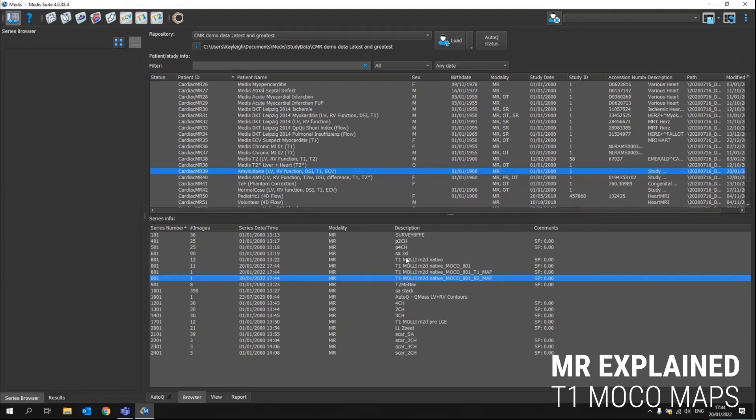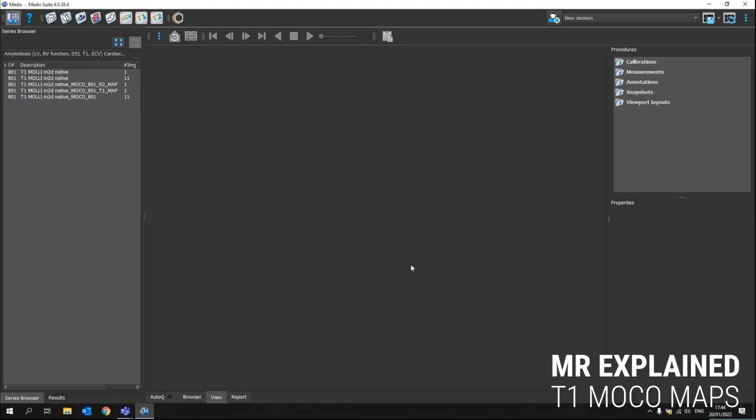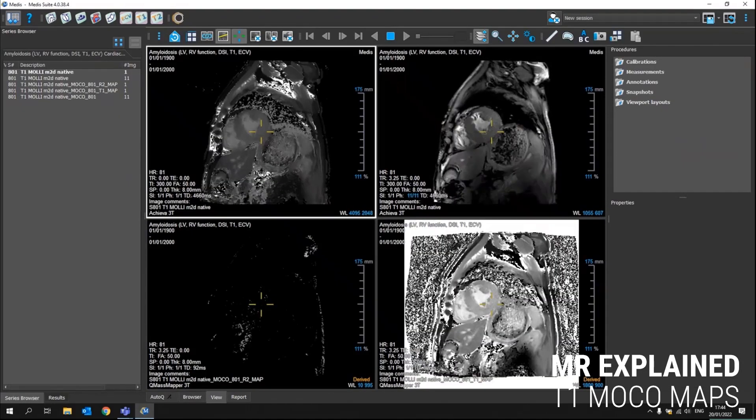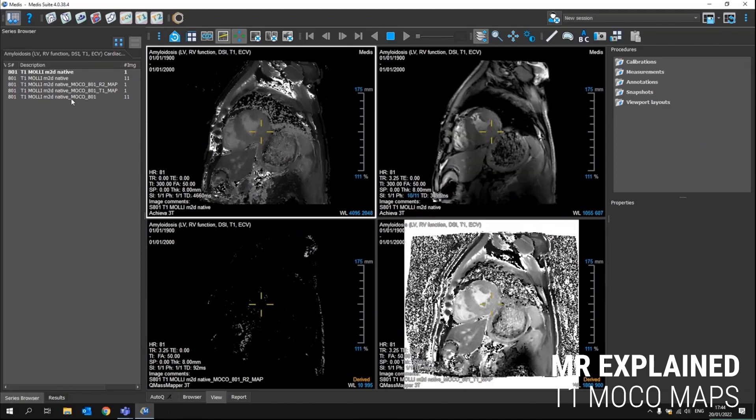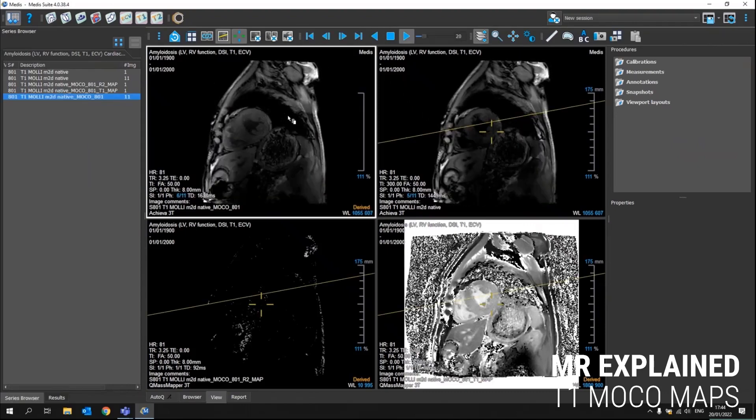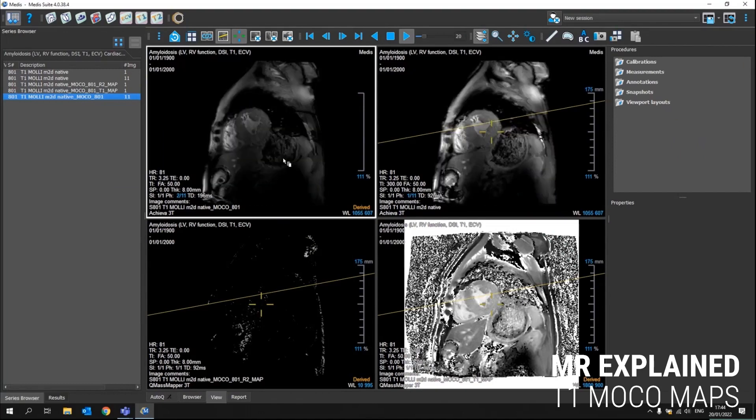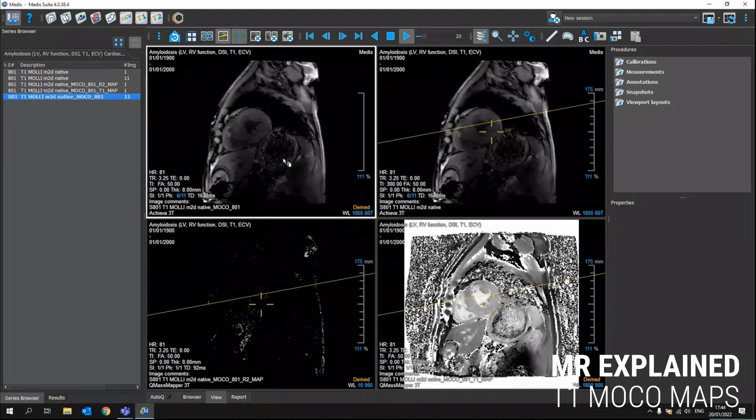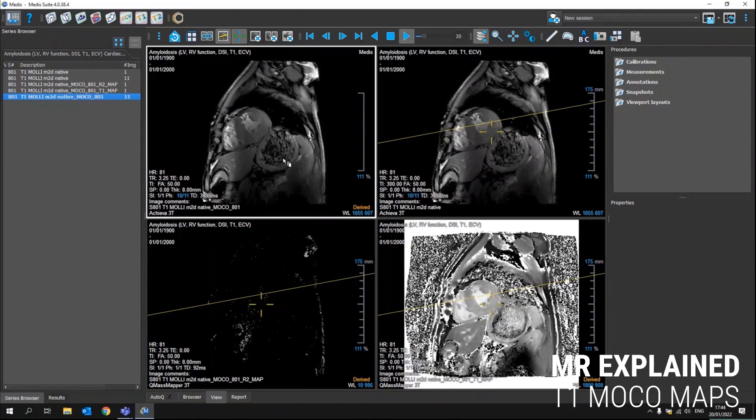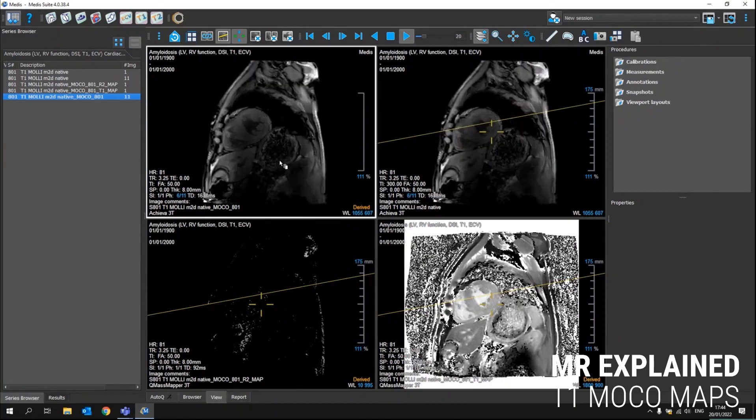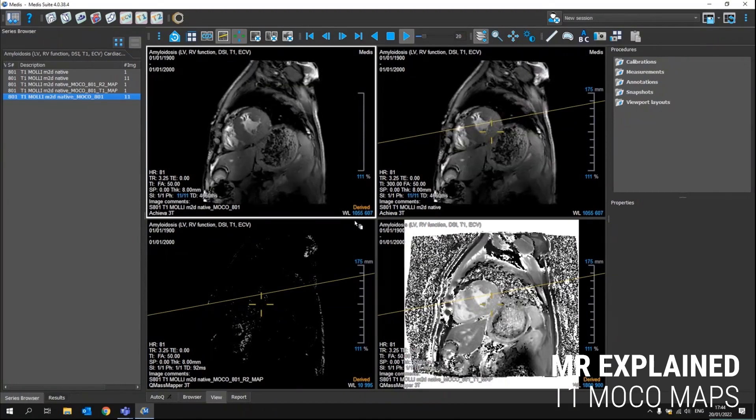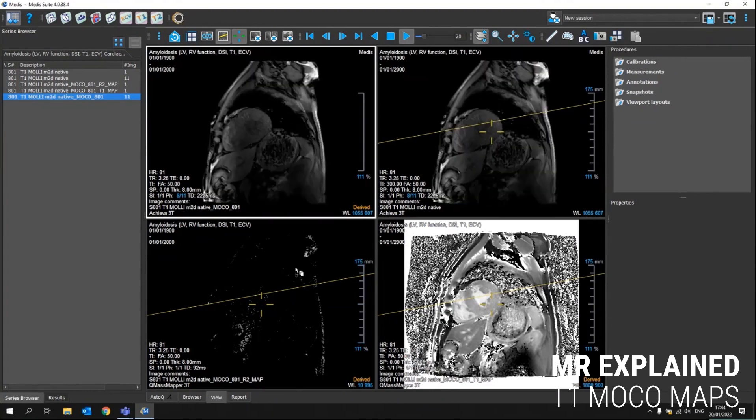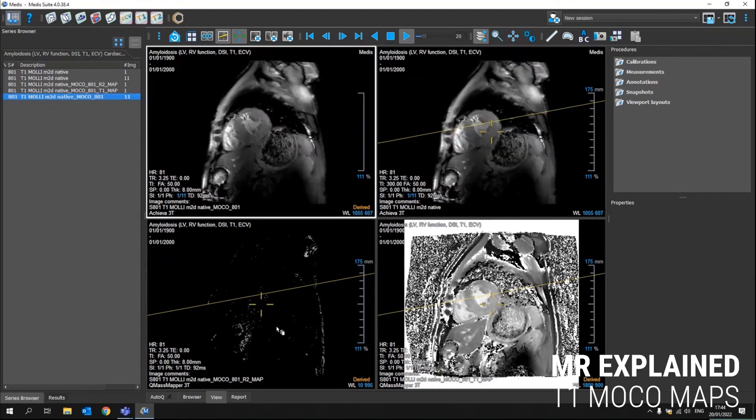Let's load those four series into MetaSuite so I can show you the differences in there. So this is the original series and this is the derived one with motion correction. You can already see a bit of differences in there. And from this series, the T1 map has been created, which you can see in here and also the R square map is created.